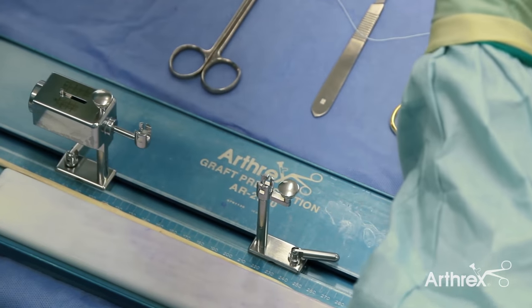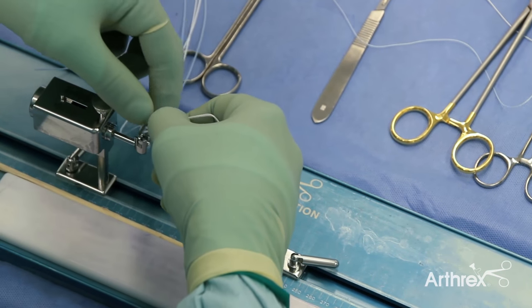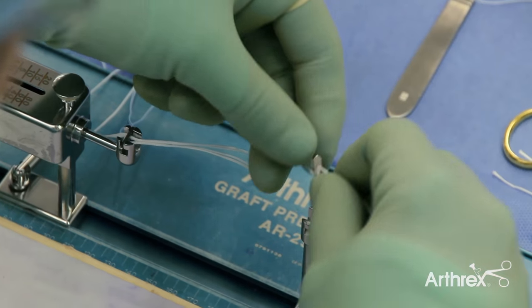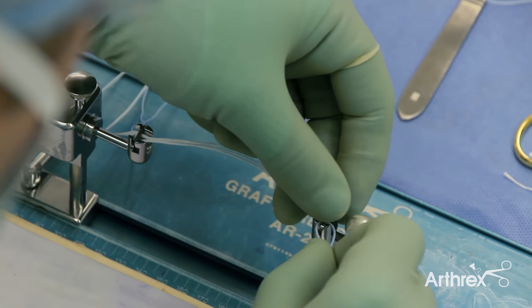The ACL tightropes are loaded onto the graft preparation station such that all graft preparation can be carried out without an assistant.